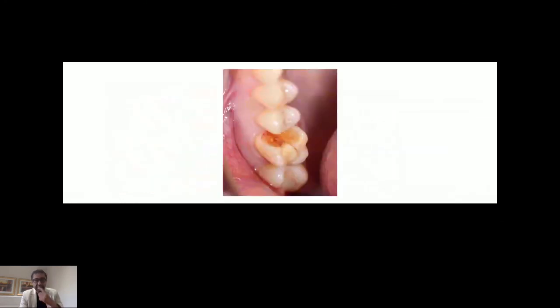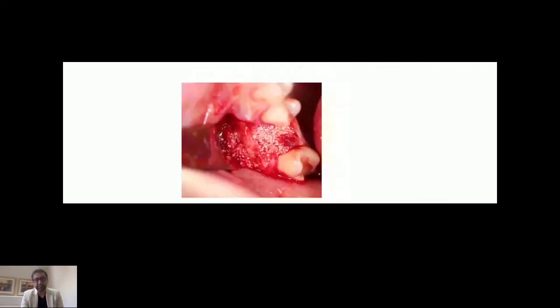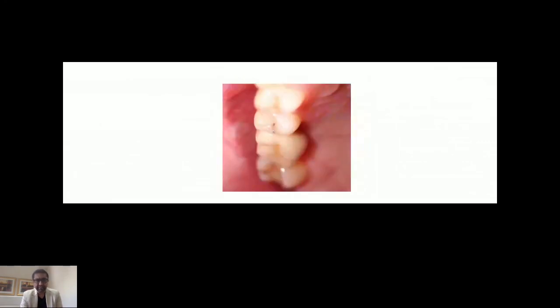Once again, another broken tooth. When you've got broken teeth like that, make sure that the way to take these teeth out atraumatically is to divide the tooth, not the bone. So don't touch the bone, but divide the tooth, so that when you remove your tooth, the bone is untouched and is not damaged. So we divided the tooth, took the tooth out, bone grafting done, osteotomy done, and we placed the implant in. And look at the keratinized mucosa. You must have seen this in all the pictures I've shown you just now. The keratinized mucosa is the same in all pictures. The reason being that if you do not have good bone quality or quantity, you cannot ask the mucosa to be like that. You have to provide the good foundation for the mucosa. And that's the final picture.